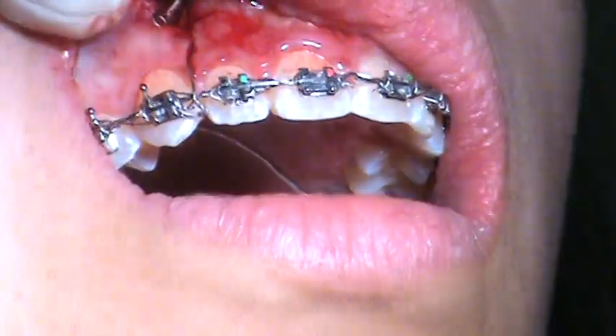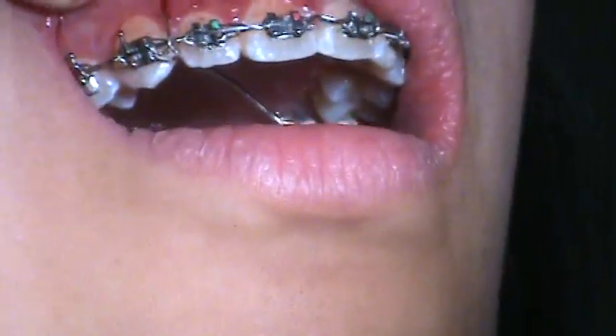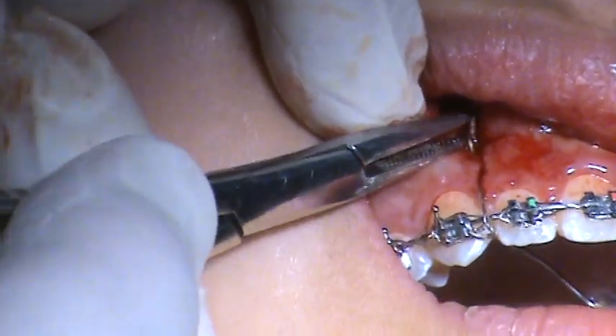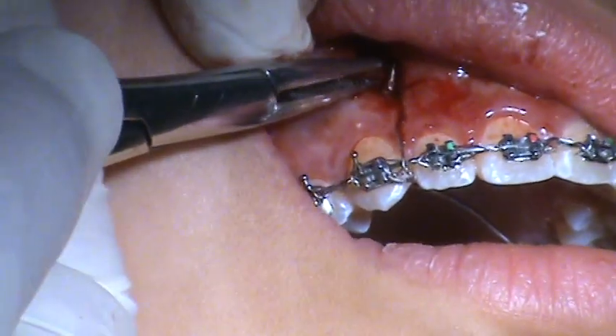And then we'll have another piece of ligature. The passive coil is at the CEJ.